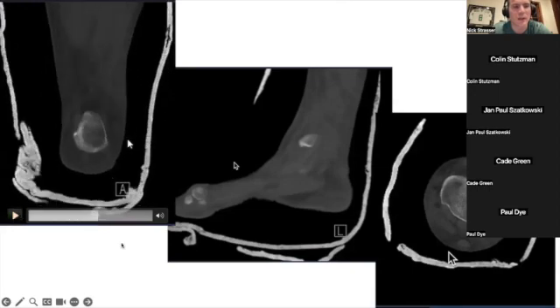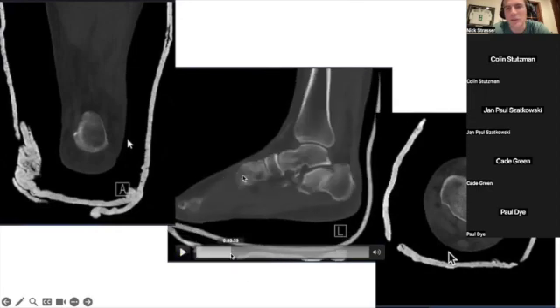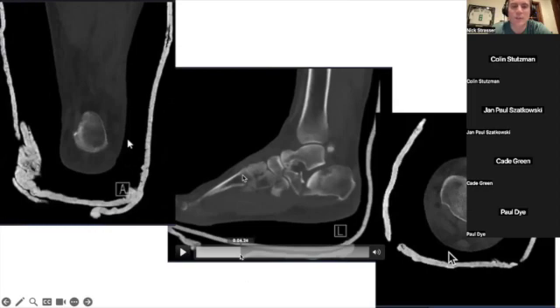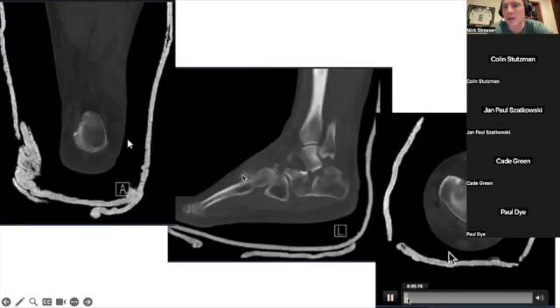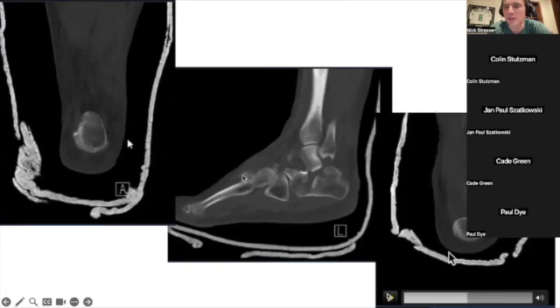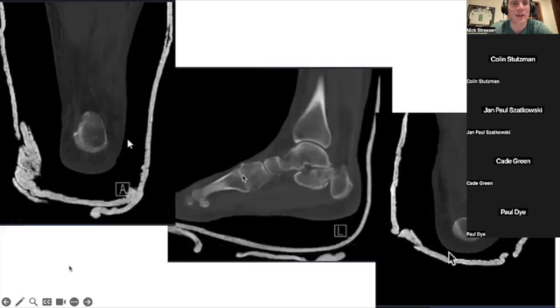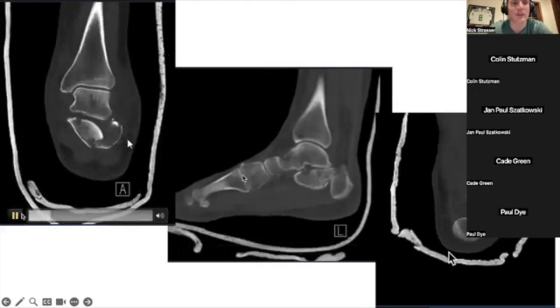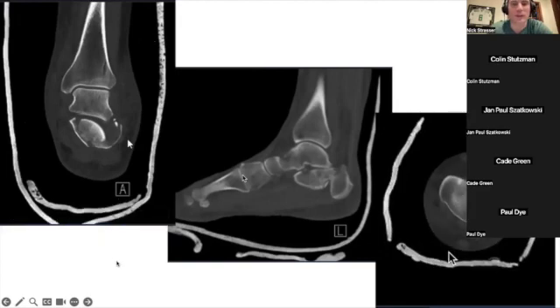You can see it's pretty depressed in this case. She's pretty active, a little bit older to consider surgery, but I felt like it was depressed enough. And now with sinus incisions, I felt it's a little more safe to go ahead, especially as you pointed out, in an acute setting fixing these earlier may avoid some issues, especially if you're using a sinus incision.